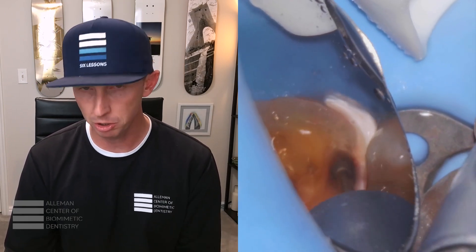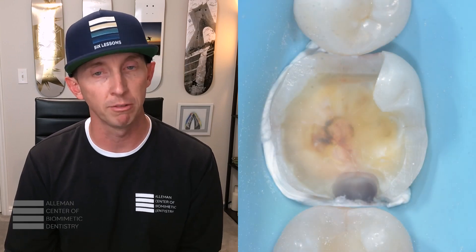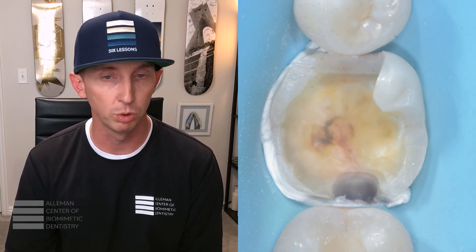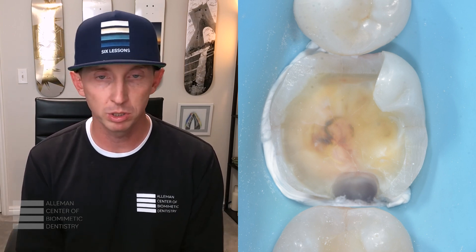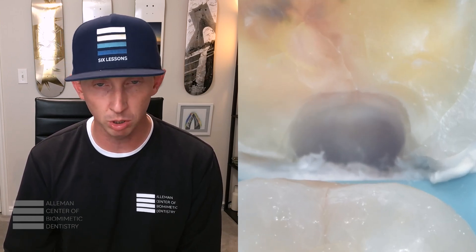I view fractures not only as a structural defect, but also as a pathology that can infect a pulp or cause a tooth to be lost. After removing another millimeter and now being very close to crestal bone, we are beginning to see that the fracture has been eliminated in the peripheral seal zone.